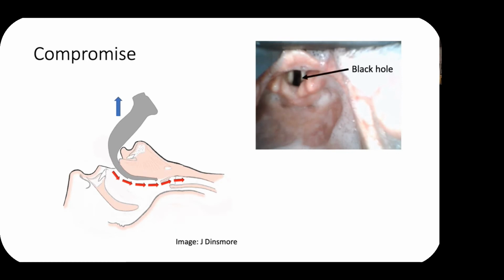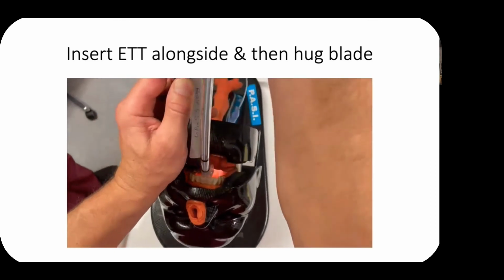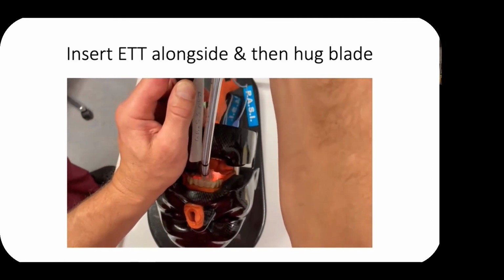One additional advantage with having the blade further out is that you see your endotracheal tube earlier, and it helps with directing the tube into the larynx. Personally, I find it preferable to insert the endotracheal tube alongside and hugging the blade. I think it keeps the endotracheal tube tip away from the pharyngeal wall, and it reliably appears on the video screen.